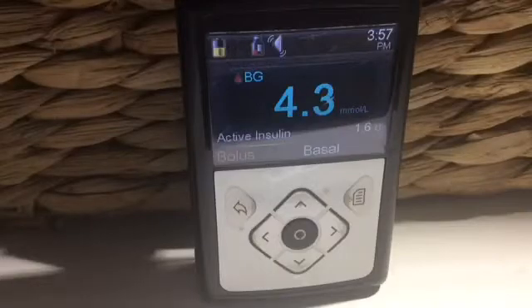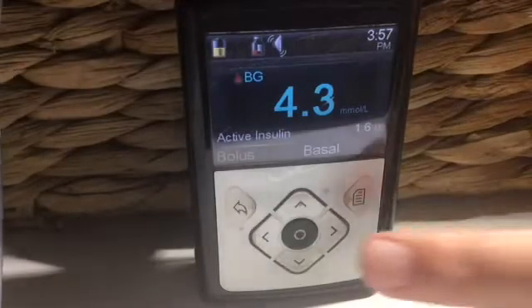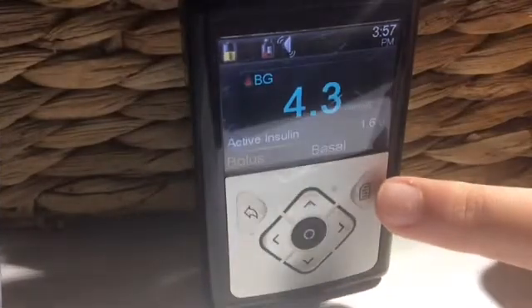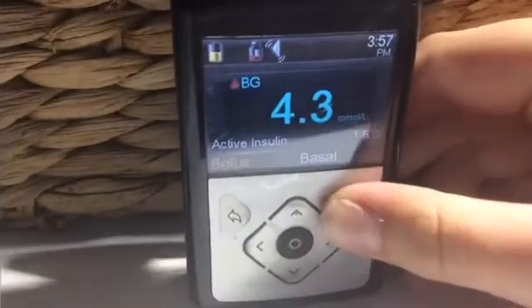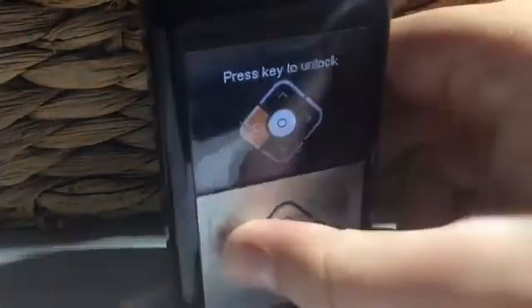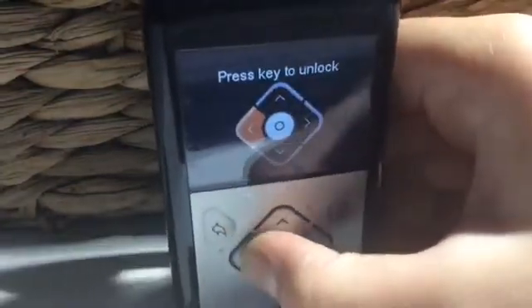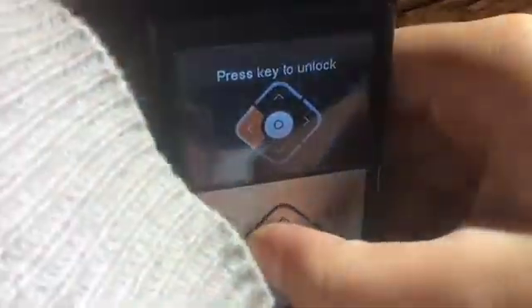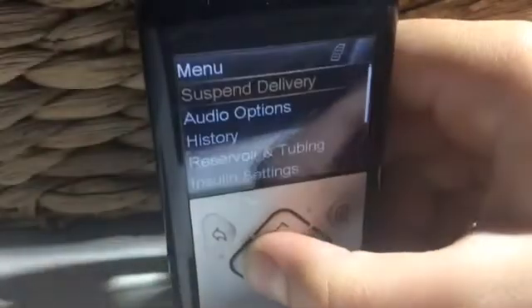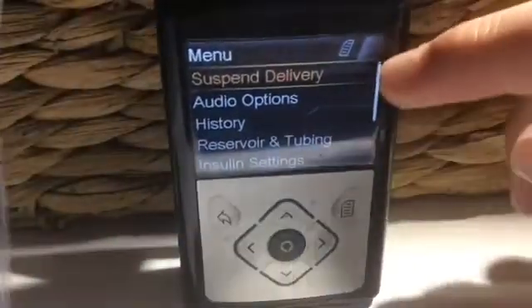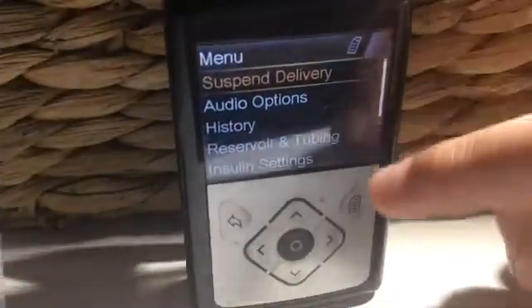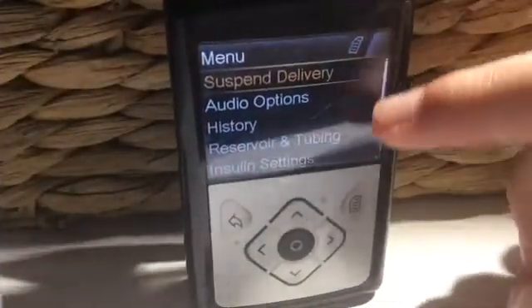I will now be explaining the document signal on the insulin pump, as you can see right here. When you click on it and unlock it again, you will see different options. I will be explaining each part briefly so that you can get a clear idea of what they are about.